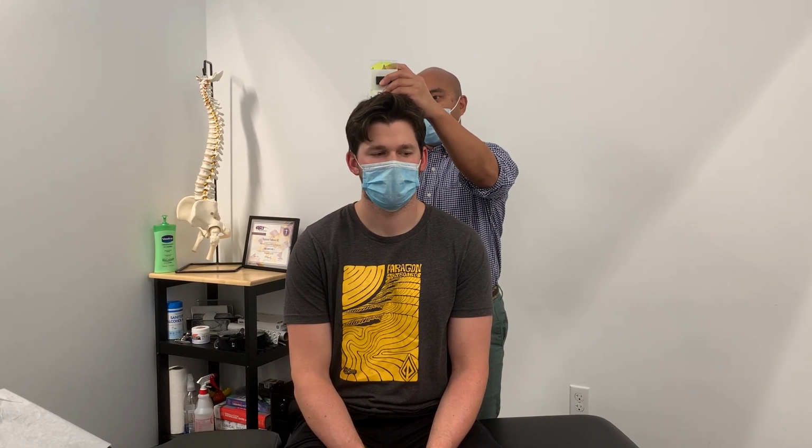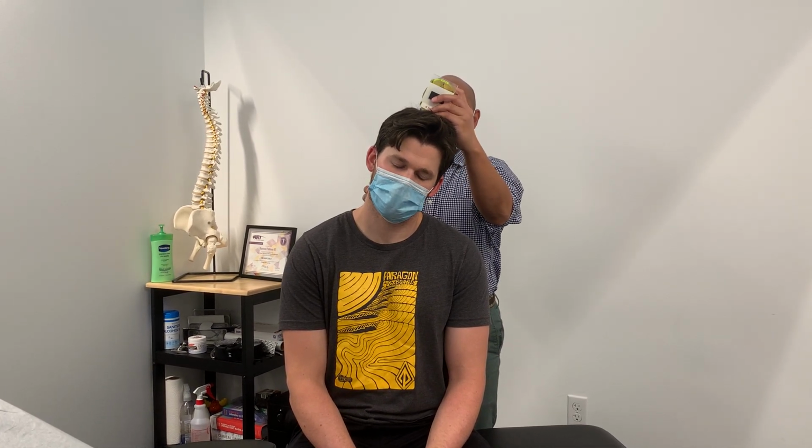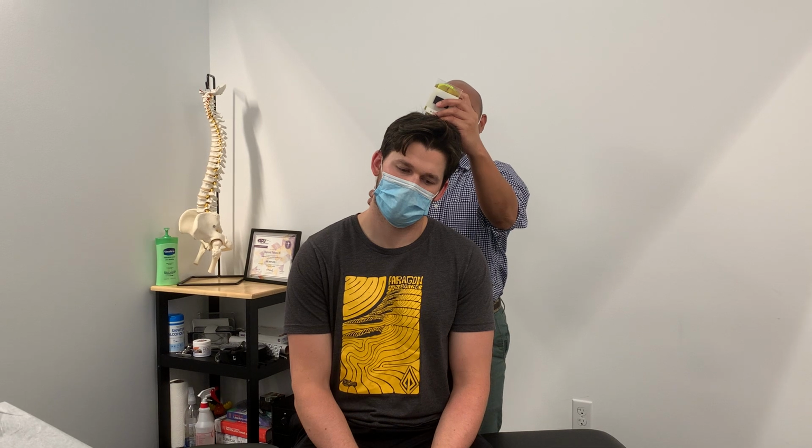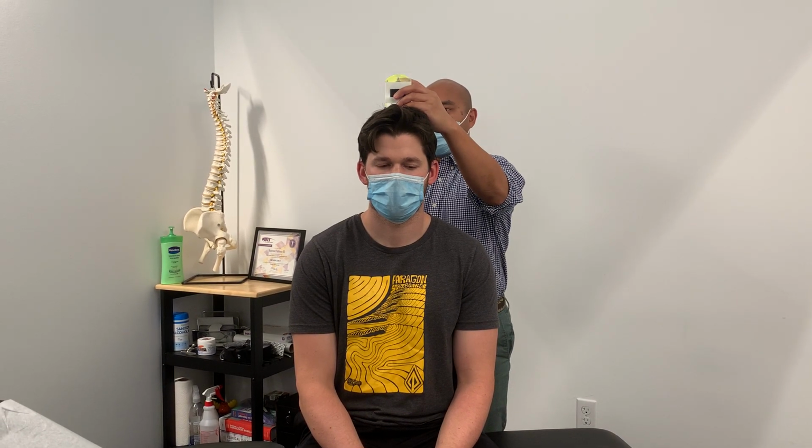I'll zero it out, and then he'll bring his left ear to his left shoulder. And again, I'll note the range of motion for left cervical lateral flexion. I'll zero that out. Once again, also asking the patient if there's any pain doing so. And then for cervical rotation, I'll have the patient lay on his back on the table, facing the ceiling.